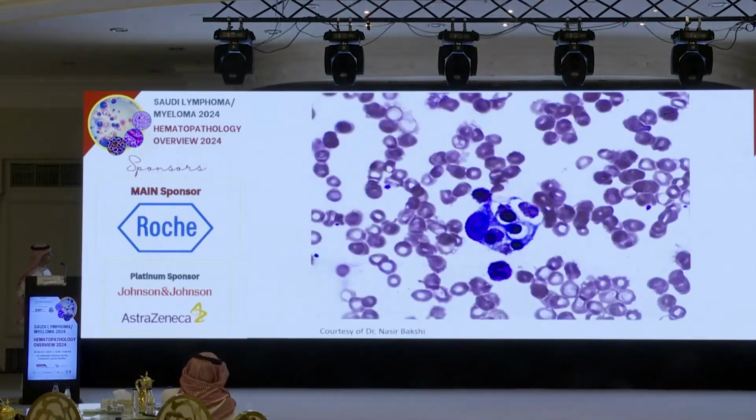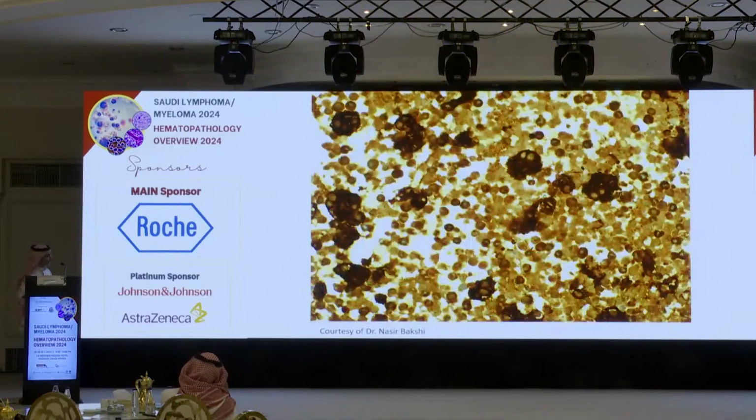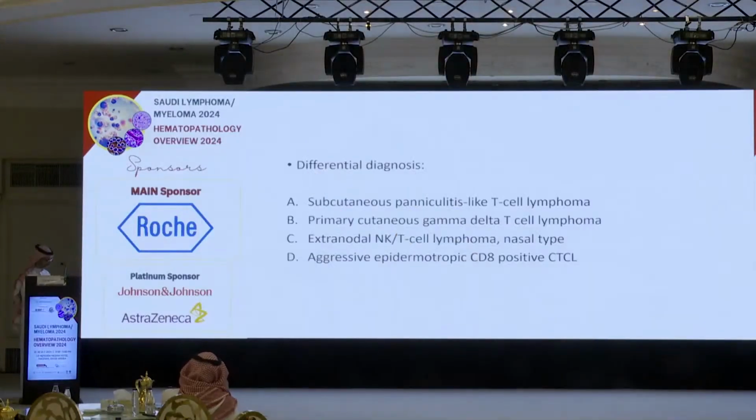in situ hybridization is negative. This is a smear from the bone marrow. As you see, this is hemophagocytosis. This is the histology from bone marrow highlighting the hemophagocytosis, and this is CD68 highlighting that. So the patient was sick.